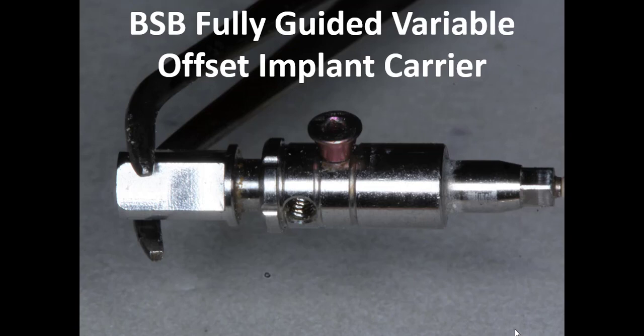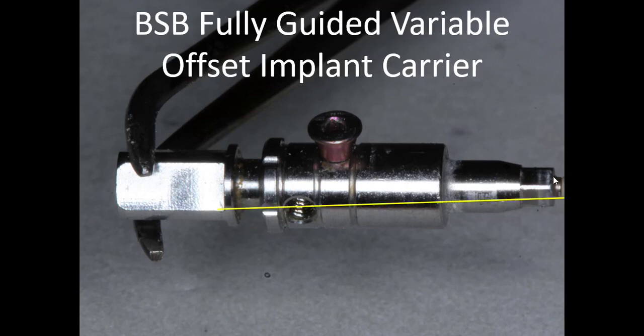Before we go to the printed models, I wanted to show the Blue Sky Bio fully guided keyless kit implant carrier. In that kit there are two carriers: your standard 8.5mm offset with a built-in master key, and the variable height offset carrier. The important thing to notice is there are six notches on the built-in stop, and those notches correspond to the flats. You can see a flat going this way corresponding to that notch — that's going to be really useful for orienting the flat exactly to the dot we made on the surgical guide.